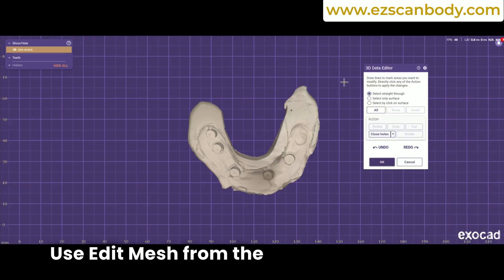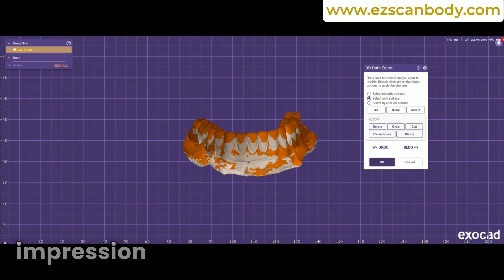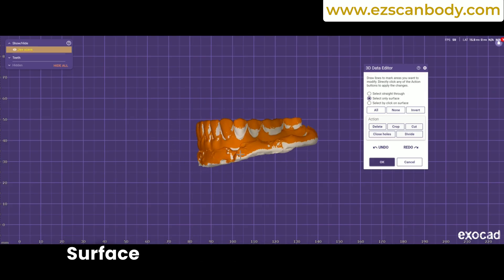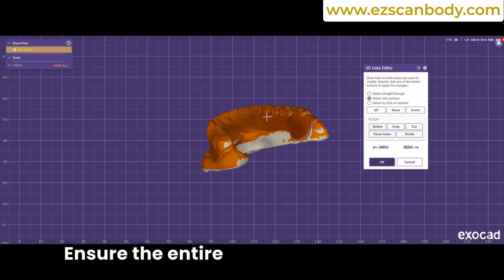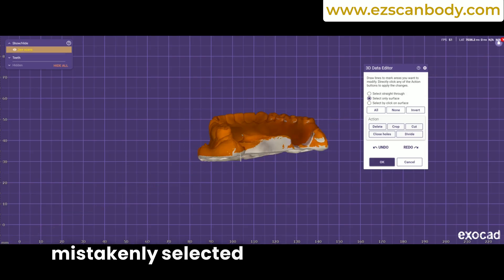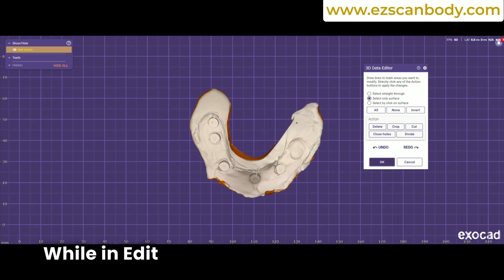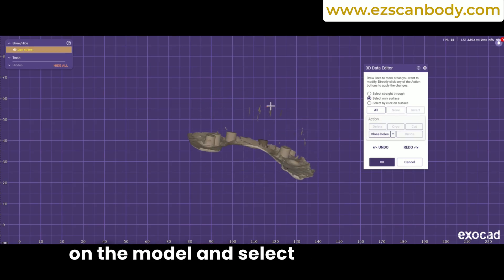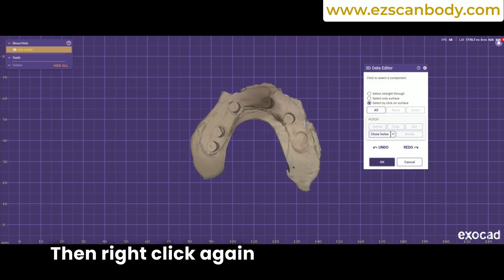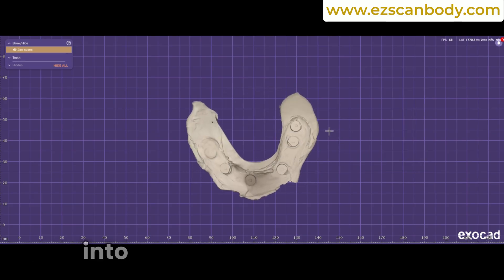Use Edit Mesh from the Right-Click Tools menu in ExoCAD to invert the impression, converting the negative side of the denture impression into a positive model. From the Edit Mesh menu, select Only Surface to isolate the top part. Ensure the entire top surface is selected and highlighted in yellow. If the intaglio surface is mistakenly selected and appears yellow, hold the Shift key and draw a selection around the area to deselect it. While in Edit Mesh mode, right-click on the model and select Show Triangle Orientation to visualize the direction of the mesh, then right-click again and choose Invert Triangle Orientation. This will convert the impression into a positive model.